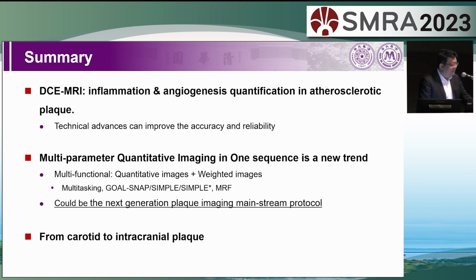And lastly, quantitative vessel wall imaging is currently moving from the carotid vessel wall to intracranial plaques. And I hope we can have good results.